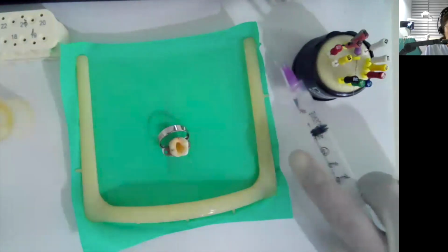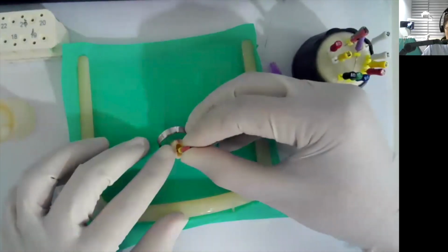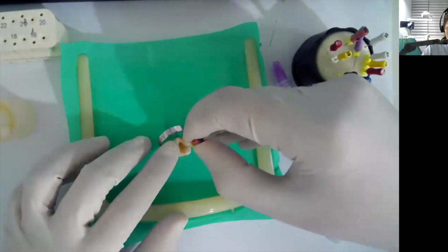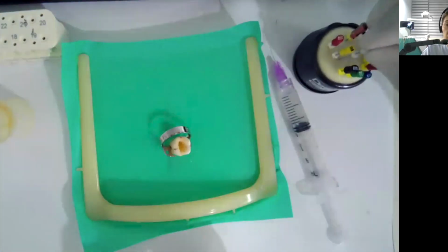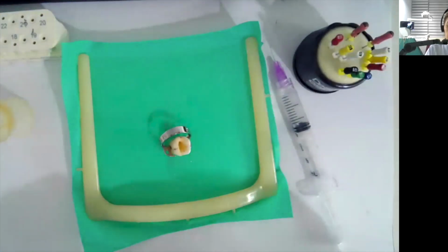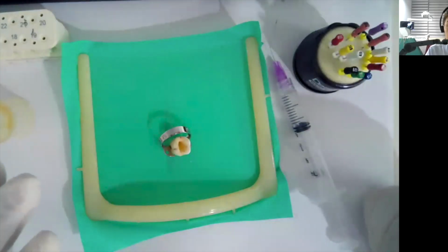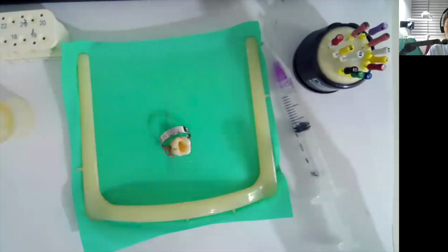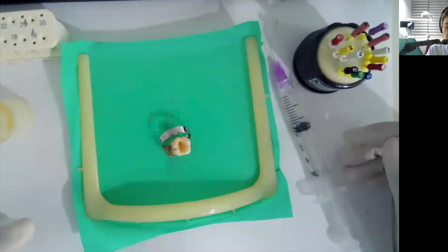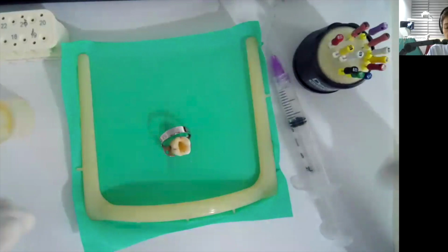Okay. Now I'm going back to my patency file. Look, it can easily get in on the mesiolingual and then on the distal. I'm now ready to do my working length. I'm going to select my IAF. And how do I select it? My tooth length image is 23 millimeters. I will try to insert a file that will reach 22.5 millimeters, and it should have a resistance.